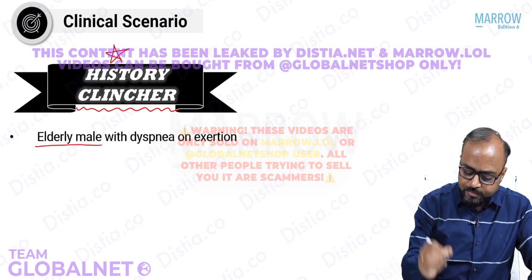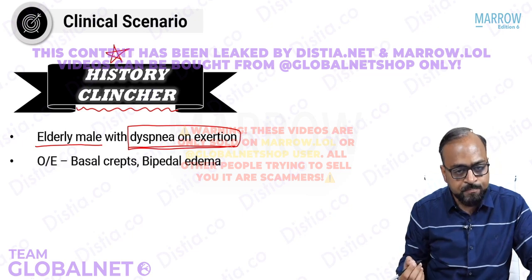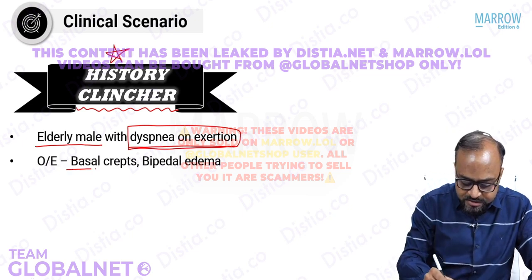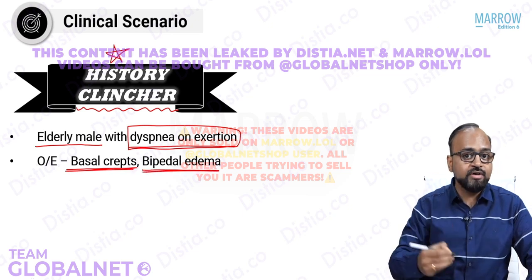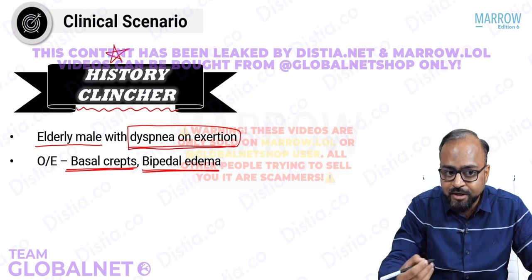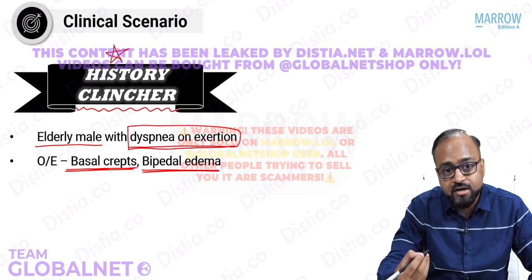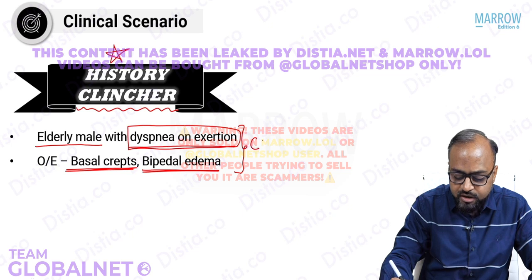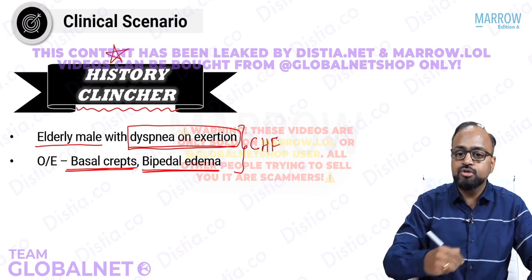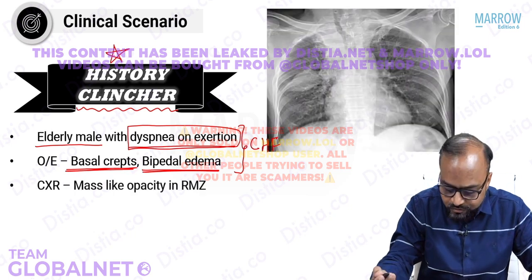It is an elderly male who presents with dyspnea on exertion. So typical cardiac complaint, dyspnea on exertion. On examination, there are basal pulmonary creps and there is bipedal edema. So now I know where I am getting into. Elderly male, dyspnea on exertion is a cardiac complaint. Basal creps, bipedal edema are cardiac signs that are probably pointing towards a case of congestive heart failure. So this could be congestive heart failure. I'm thinking along those lines. On chest X-ray, what is seen?